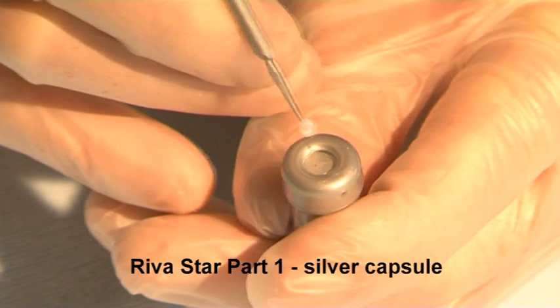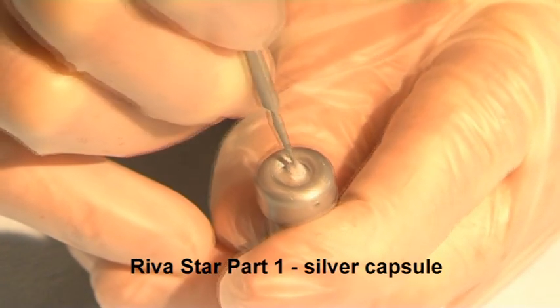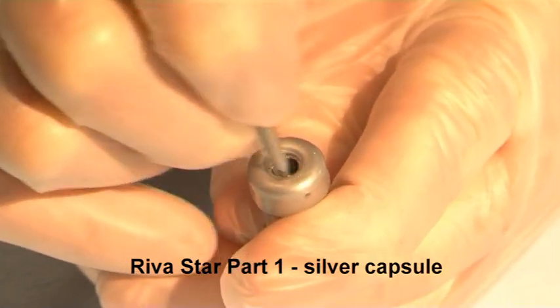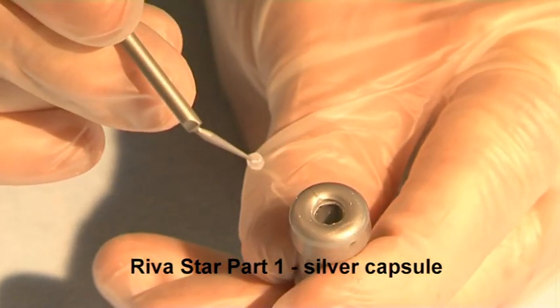Pierce the foil cover over the grey silver fluoride reservoir using the grey brush. Rotate the brush to push the foil to the sides of the reservoir. Bend over the brush and remove it from the reservoir.